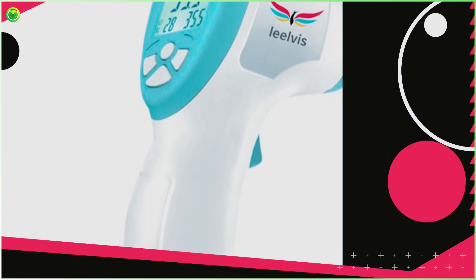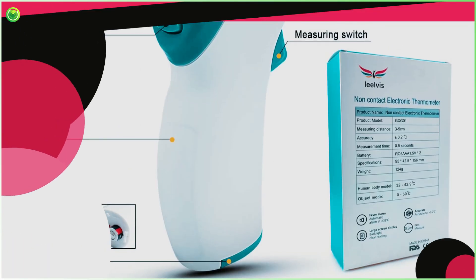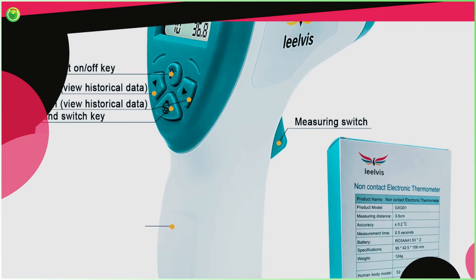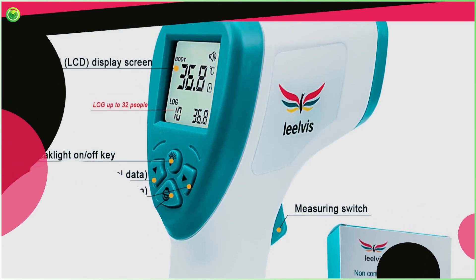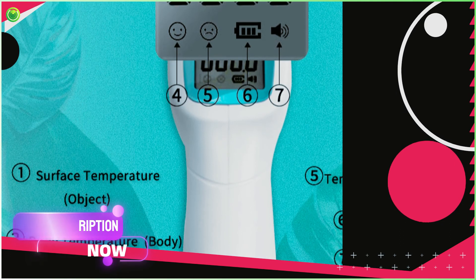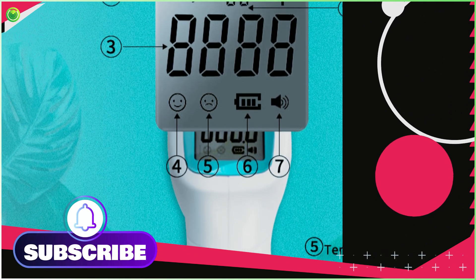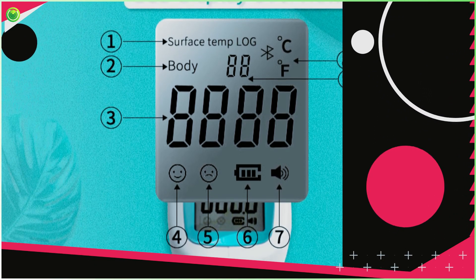Hovering Method: Turn on the thermometer. Point the device one or two inches away from the user's forehead. Press the thermometer button to display two red circles on the forehead. Move the device until both circles merge into one. During this process, the patient has to remain on standby until it completes. Release the button and wait for the temperature indicator sound. Add one degree more to the given temperature to get the inner body temperature.